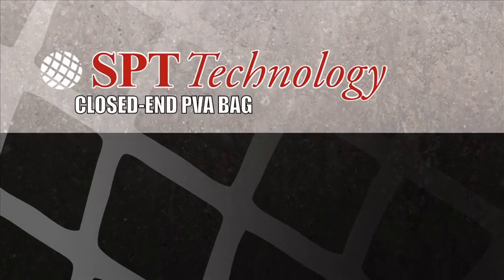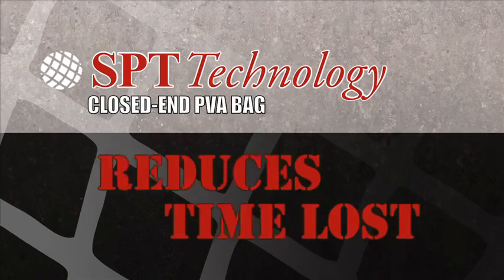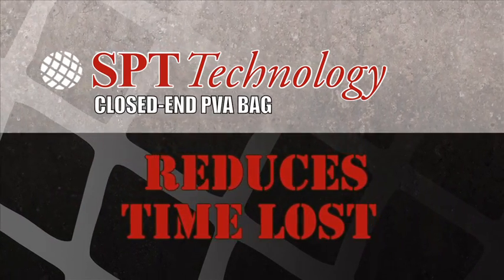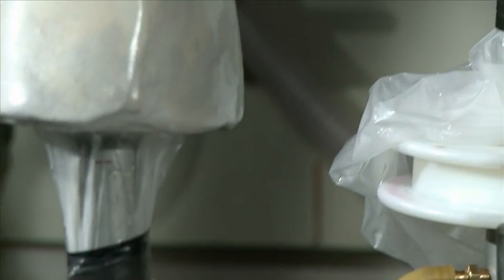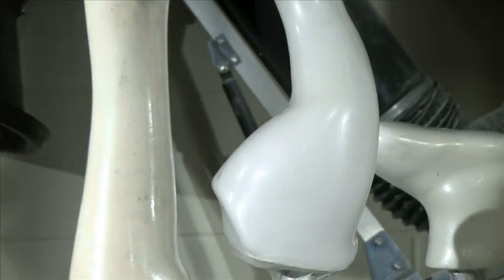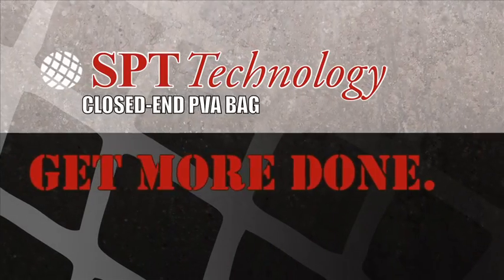The SPT Technology Closed End PVA Bag increases your productivity by dramatically reducing time lost preparing a model for lamination. Instead of spending endless time in multiple steps sealing your cast and removing imperfections, you'll be free to get more done.